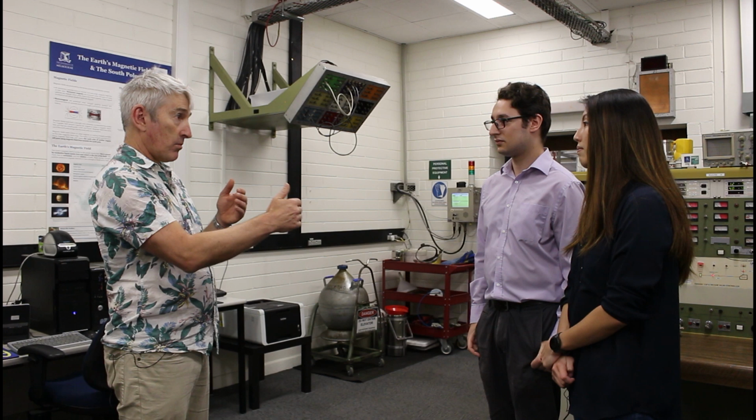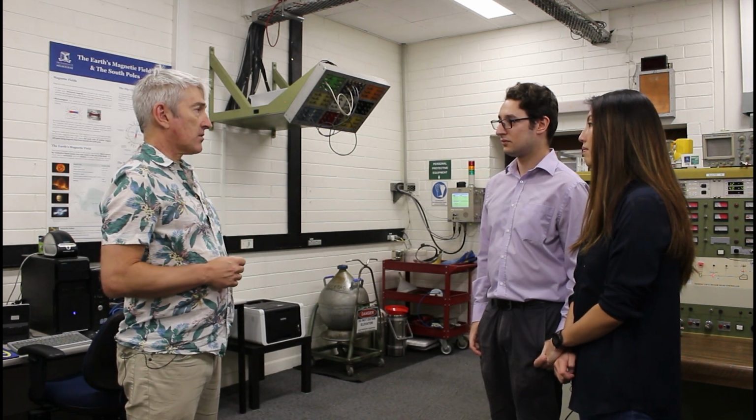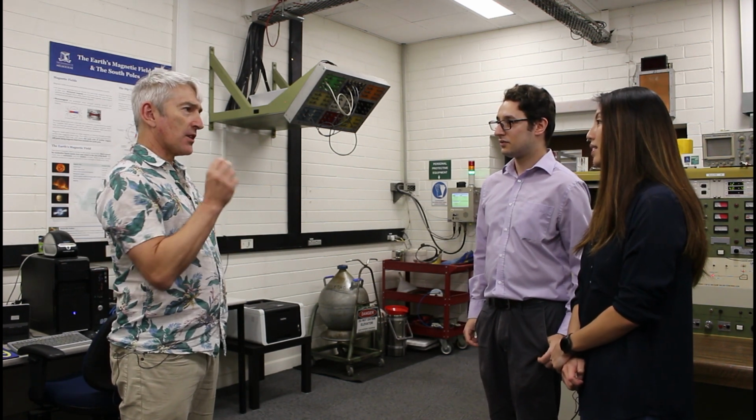cost of proton therapy. I guess that means that you would need to know very clearly how far you need to get it, and yeah, that sounds quite tricky. Getting the formula just right to drop the energy in. There are equations you can use to predict where the Bragg peak will lie, but in practice, the equations by themselves aren't going to be quite enough.